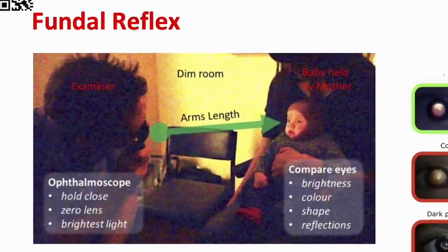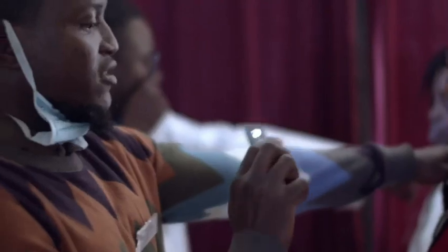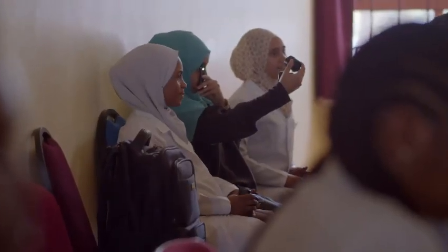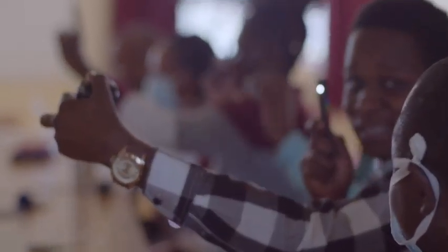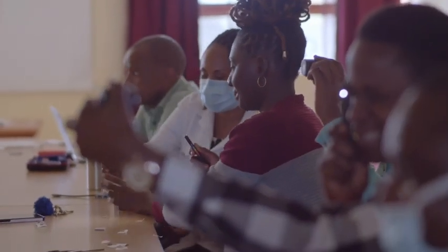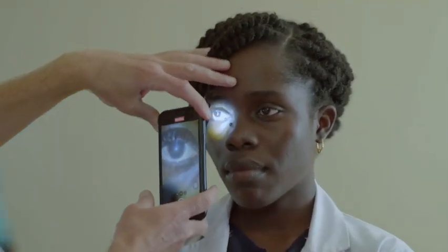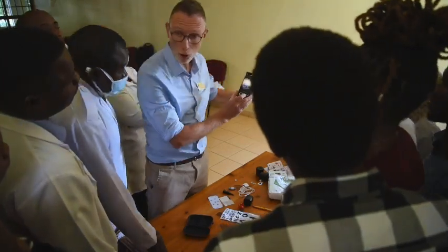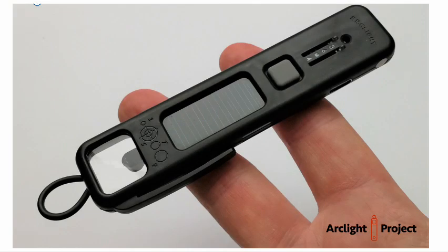Local trainers are encouraged to lead with supervision and explain how to use the Arclight device using videos, posters and handouts. Participants then go on to use the device, examining each other, as well as dedicated simulation eyes that we have created to illustrate normal and abnormal findings. The eyes allow for training, then assessment, and generate a fun interactive learning experience, finally finishing with illustrating clinical signs using the Arclight attached to the camera of a mobile phone. And so that's the Arclight direct ophthalmoscope, a cost-effective and simple means to scale fundal red reflex screening in both high and low resource settings.